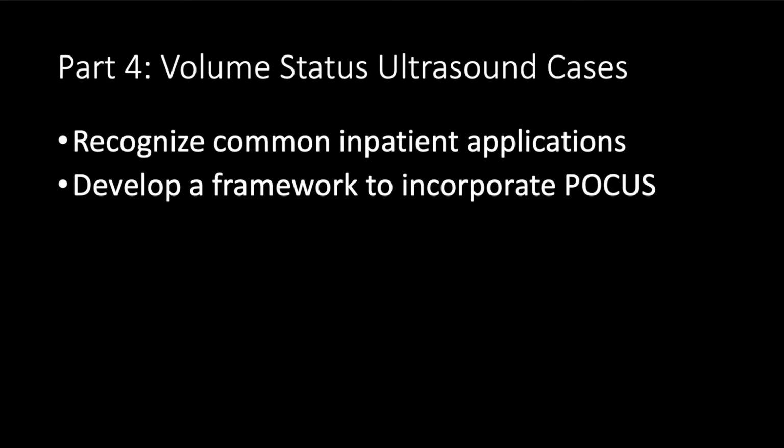I really want you to recognize common inpatient applications for volume status assessment and also give you a framework or an algorithm to incorporate point-of-care ultrasound into your decision making. So without further ado, let's dive on in.